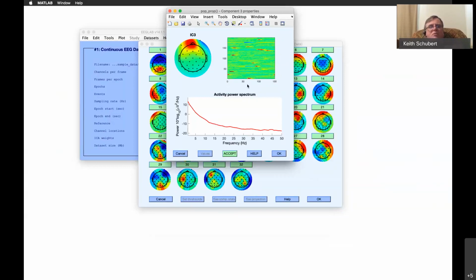And usually when you see these little kind of hot spots scattered, that is very characteristic of blinking. Usually you'll get kind of like a whole wide band that will come across if it's a normal situation. I'm willing to bet that's a blink, but I can't tell exactly for the moment. They sometimes give you a graph in here of time, which is helpful. But at the moment, I'm just going to okay this.